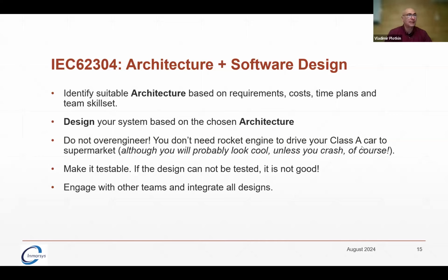They also need to look at the time allowed for the development, and they need to look at the team composition, so what kind of skill set people they have inside of the team. Because if they, for example, only get people who know C, then they probably need to look at the architecture around that sort of language and the tools they can use.